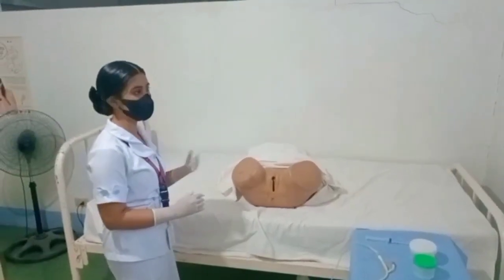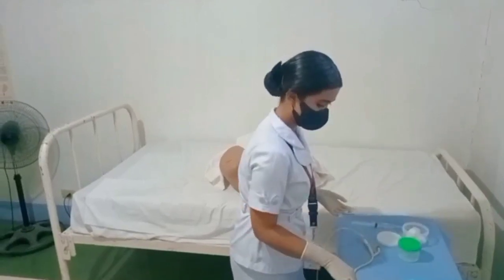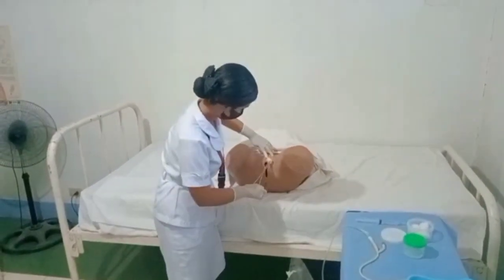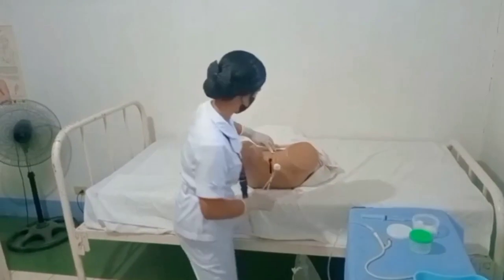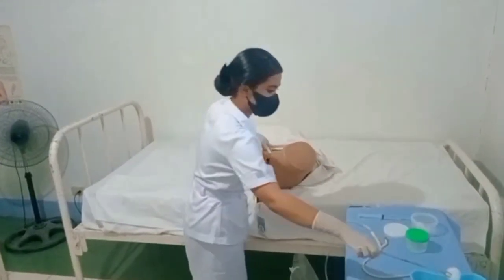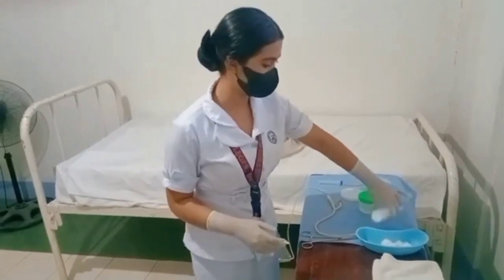Next, I am going to clean the urinary meatus. And next, I am going to lubricate the distal portion of the catheter using the lubricating jelly.